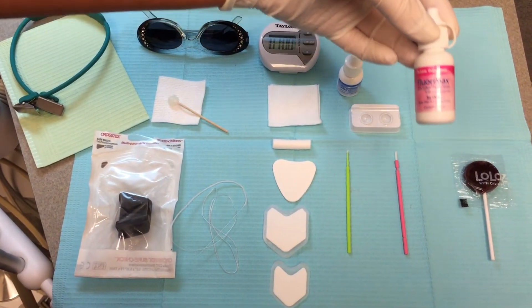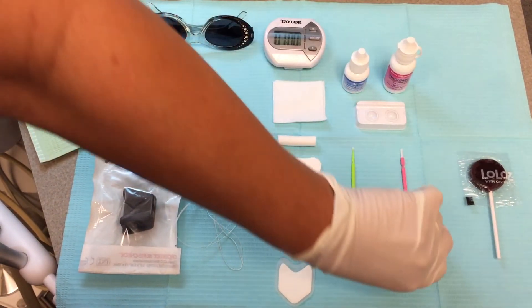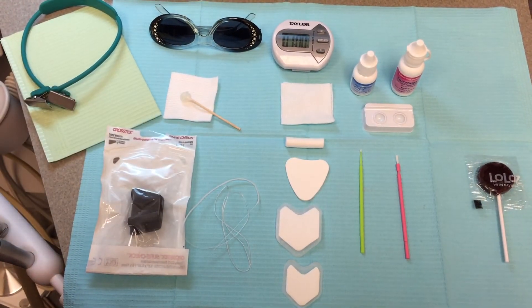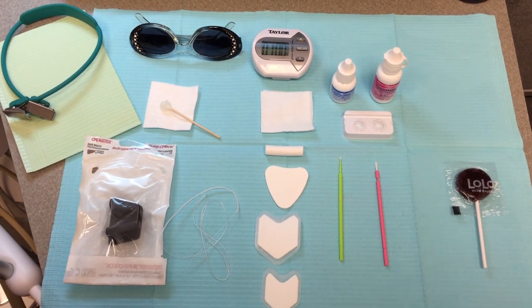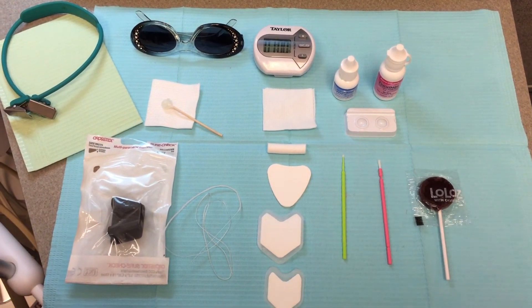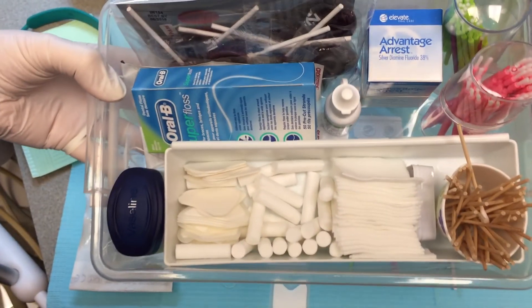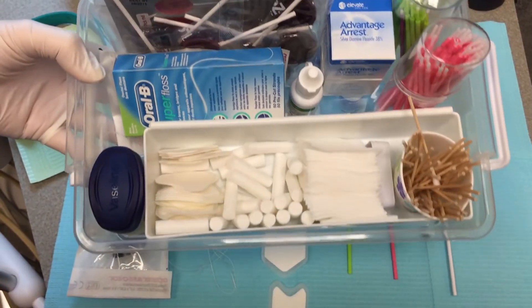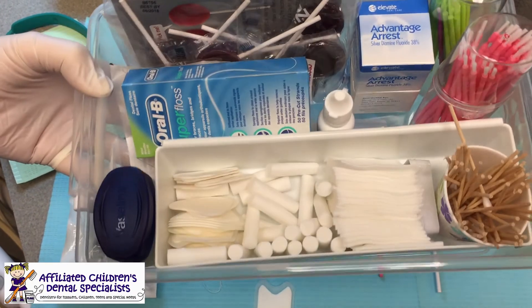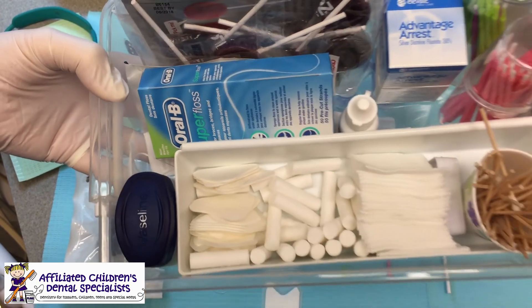Compared to opening an entire unit dose of varnish and throwing a lot away, this is more convenient and cost effective. You'll also need a little brush for the varnish. To be really nice, since SDF can have a little metallic taste — even sometimes when applying the varnish — you can give the patient a xylitol lollipop. We keep everything in a little plastic tray, probably from Walmart or the dollar store. It makes it nice and convenient, and you can carry it from room to room.